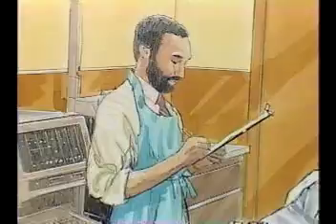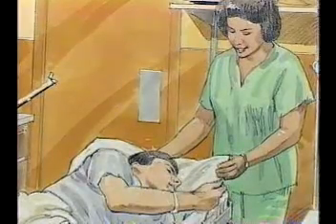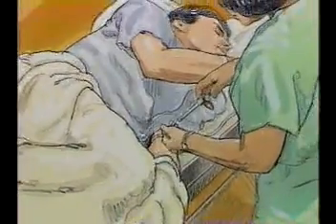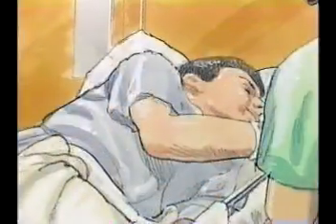The colonoscopy will be performed in the doctor's office or in a special room at the hospital, where you will be asked to lie on your left side on an examining table. You will be given intravenous medication to sedate you, and that means you will be almost completely asleep when the procedure is done. Many people, in fact, don't remember very much about the procedure after it's over.